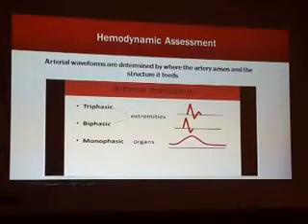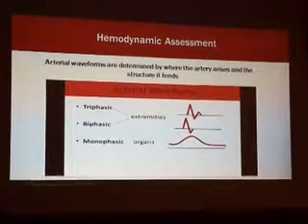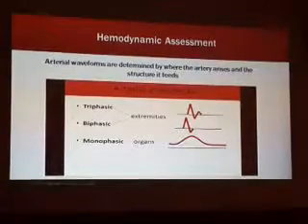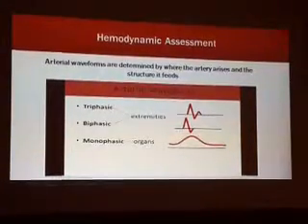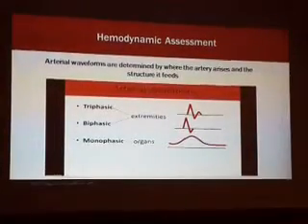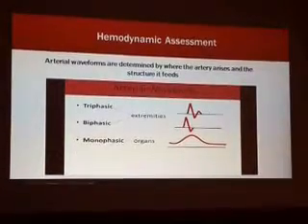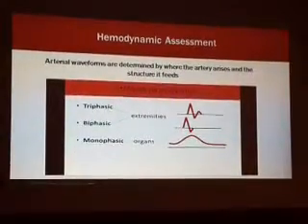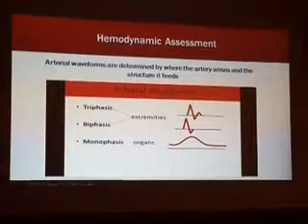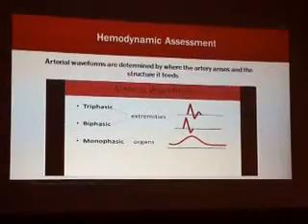So now you have located your artery. You know exactly where you should go. You know the mapping of the leg from up, from the groin down to the toes. You know the arteries supplying each part. You examined and saw the thickness of the wall, saw that there is no obstruction, and saw that there is no stenosis. Now the other part of the assessment, which is what? Spectral waveform.